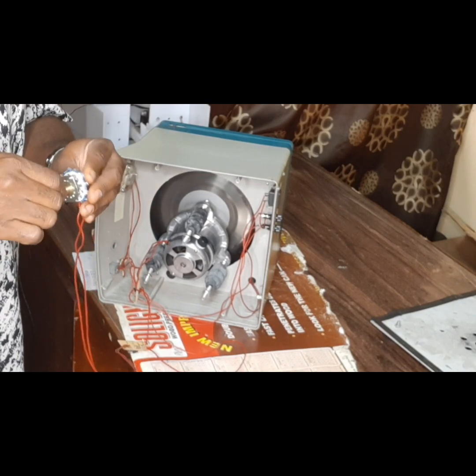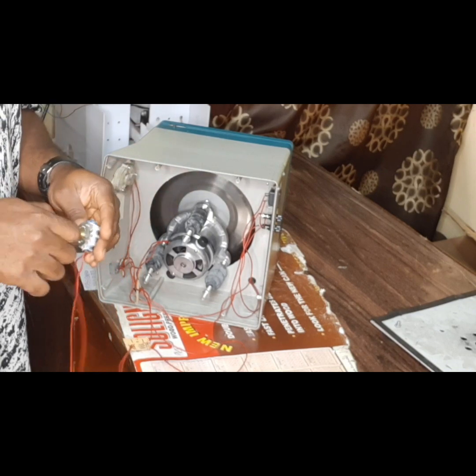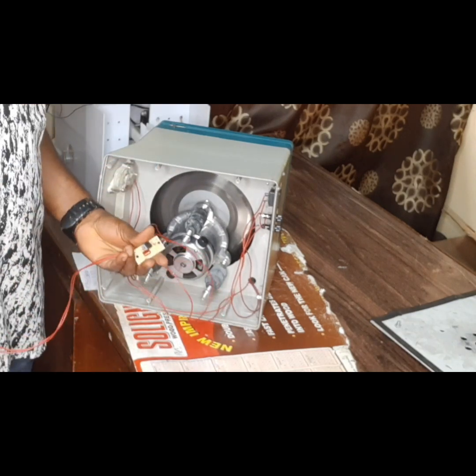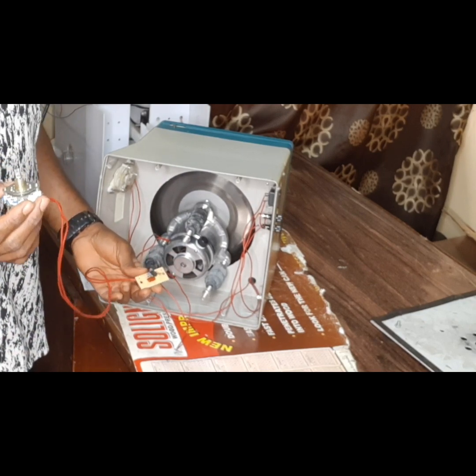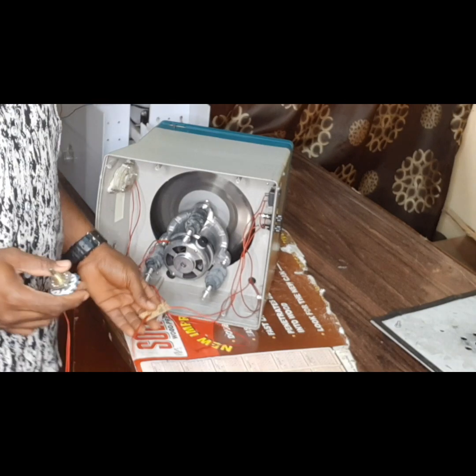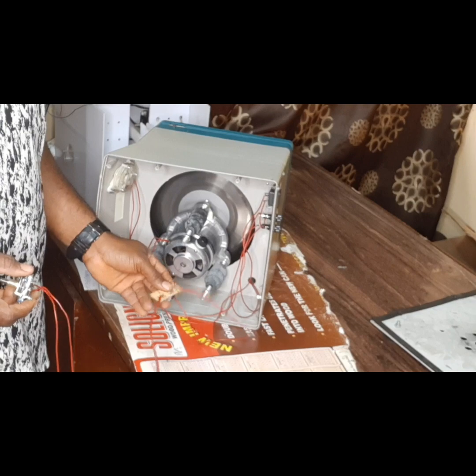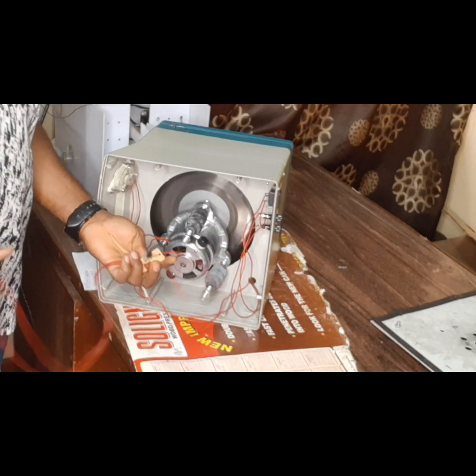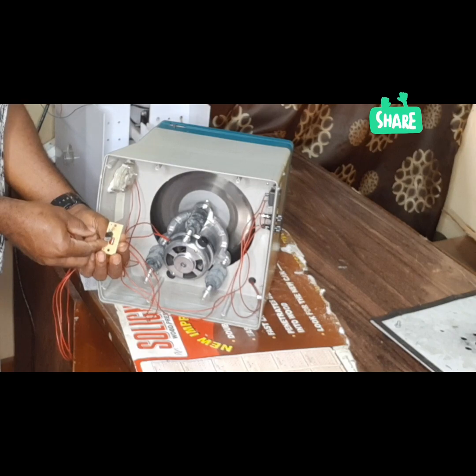So this is basically a potentiometer that increases and reduces the resistance in order for the speed to be controlled. Now, this is the associated component of this particular potentiometer. We've been able to diagnose that this very part is bad. You can see that there is a kind of burnt part here. So in order not to waste time looking at what the fault is, you can even see that the component is out of its position.